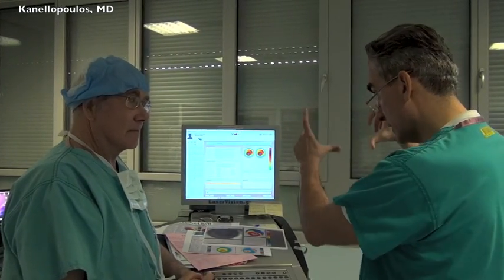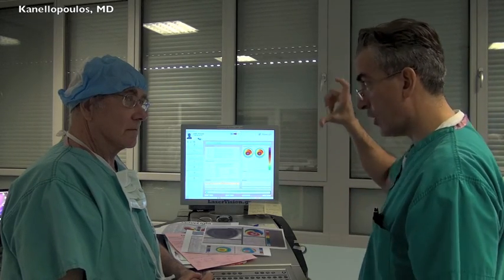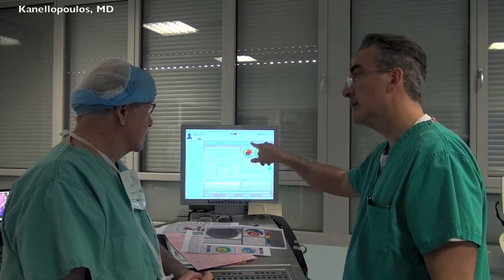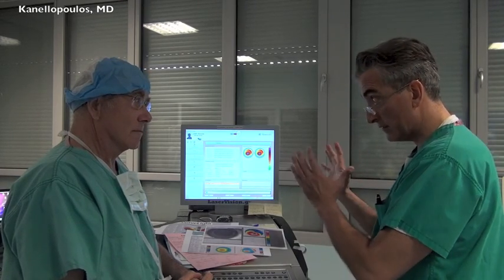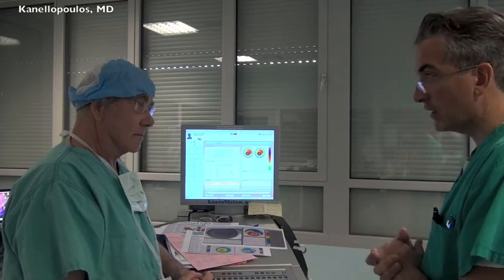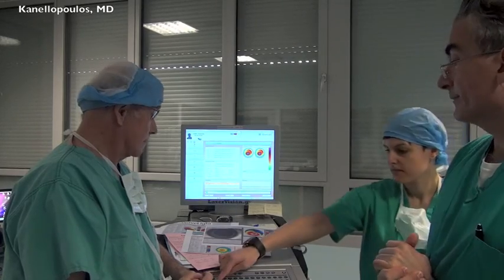So we use the OCT plotting of where the thinnest part of the cornea is and see how that corresponds with the most elevated part on the pentacam and the steepest part on the placido. So if we have discrepancy, we'll put other tools in to try and figure out, or hopefully hope that we have figured out the more accurate position. Good. So we're ready.